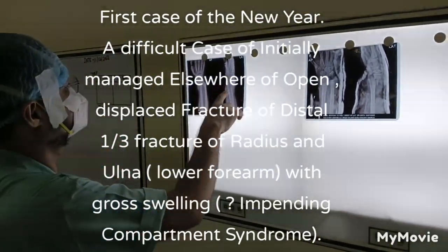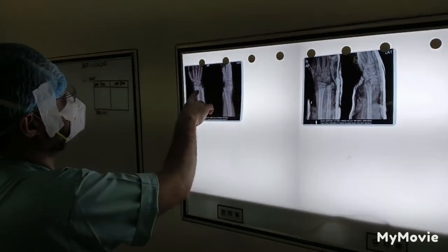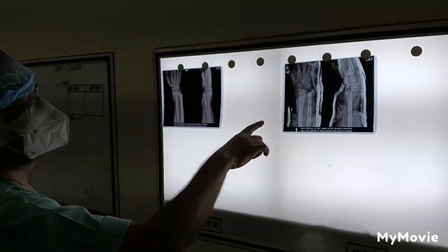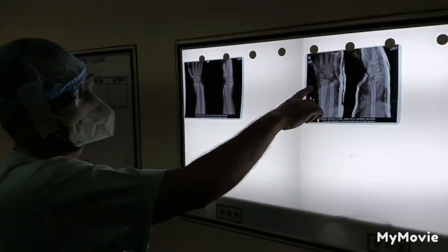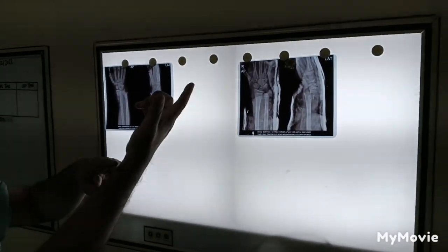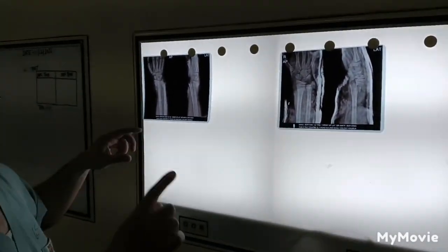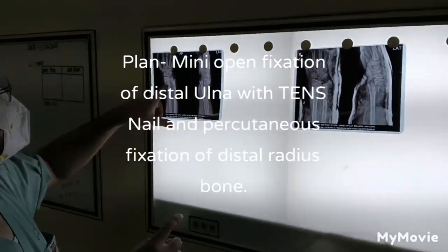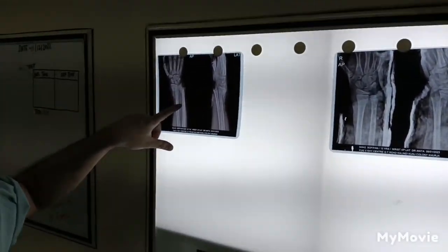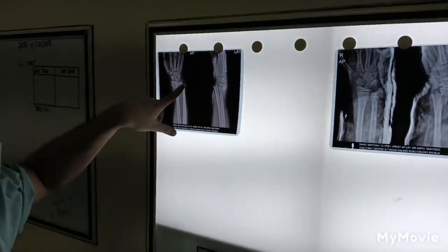Today's case is a 12-year-old male with displaced fractures of the distal radius and ulna. It was initially managed elsewhere. They tried closed reduction but failed to achieve it. There is also a wound over the volar aspect — it is an open fracture. Since there is a wound over here, the plan is to do a mini-open incision of the ulna and put a TEN nail in the ulna.